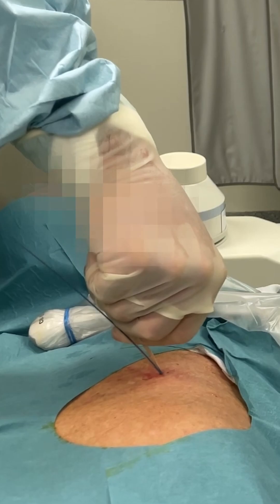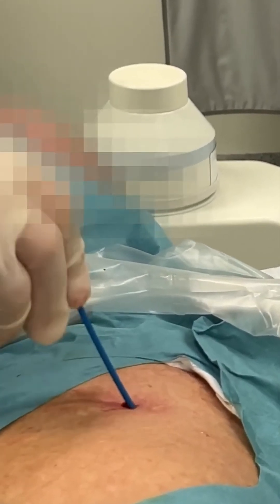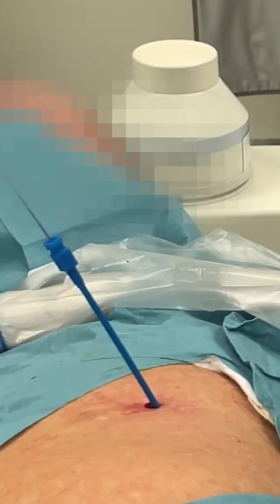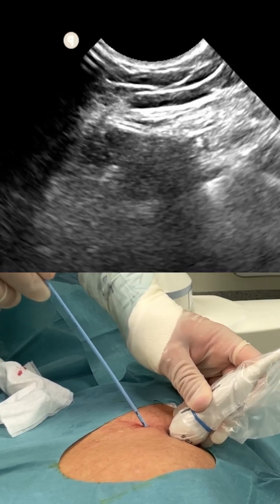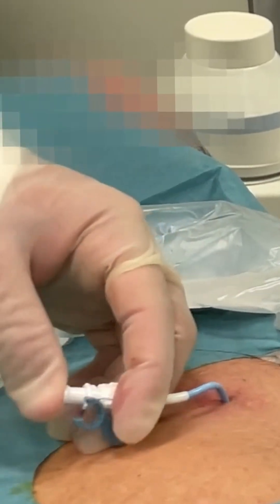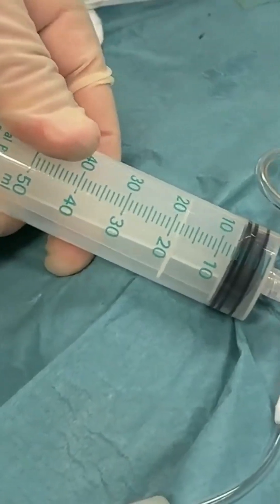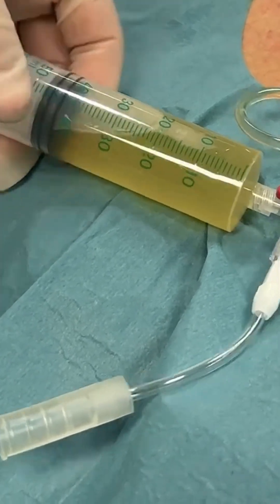This will help make sure there is no bleeding later on. A rotating motion will help if the pericardium is tough. Thread the pigtail and ensure at least 10 centimetres are inserted. It's generally best to aspirate before fixation. Push and pull the pigtail repeatedly while aspirating to reach all of the effusion.